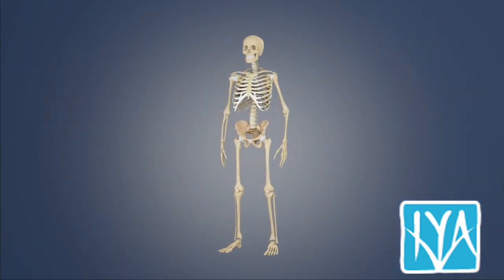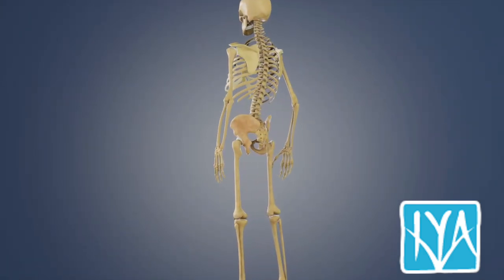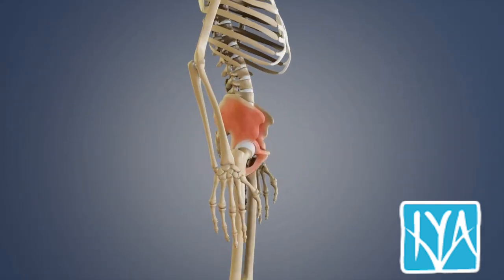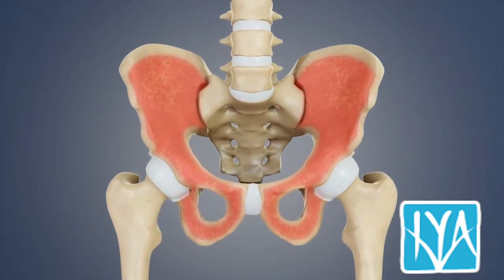Bone marrow aspiration and biopsy are essential procedures for diagnosing hematologic disorders, metastatic cancers, and marrow-related conditions. Image guidance for bone marrow biopsy reduces complications and improves the success rate of bone marrow aspiration and biopsy.